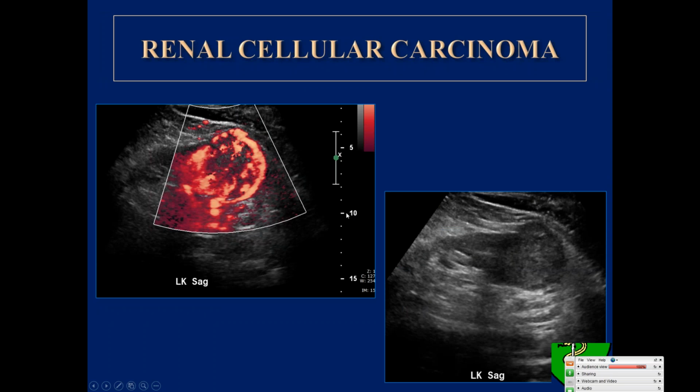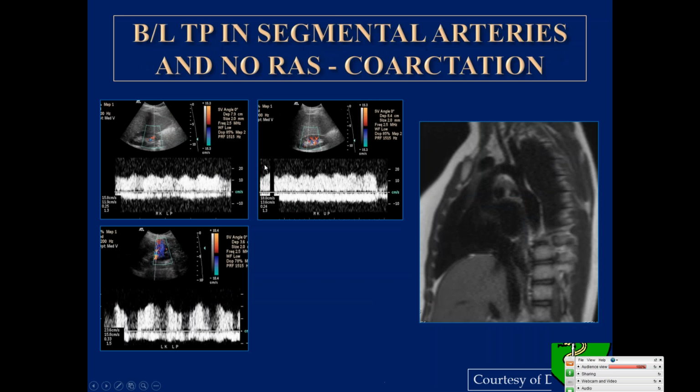area of infarction. Sometimes Doppler ultrasound can help us diagnose malignancies, either renal cancer like in this case, or we can have oncocytomas, angiomyolipomas, and we can also see if this is a normal variant of column of Bertin versus a mass. And once you see this, you can refer the patient for further management with the nephrology section.